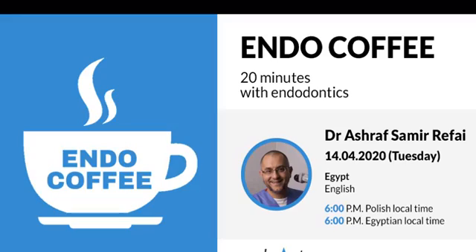But sometimes, like in the case I showed, we had a curvature in the apical part of the distal canal. That's why I used the 04. If we don't have the curvature, like in the palatal canal, in that case I can use the 2506 without any problem and go to 3004, 3504, etc.